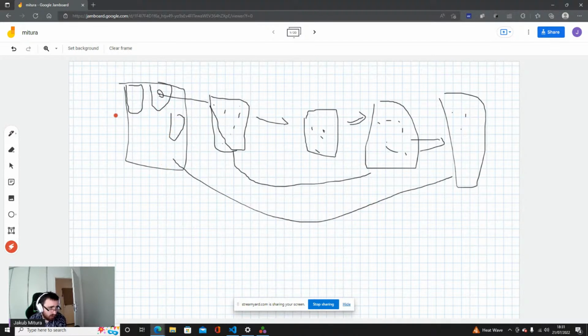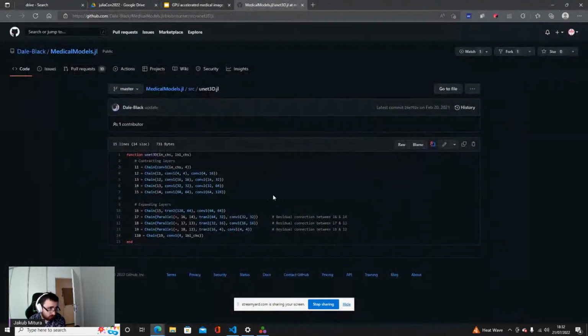Shape, because when we have these pooling layers, basically we get the compressed idea about the shapes of the things that we're interested in. But the information about the texture is mostly lost during these pooling operations. Still, in medical imaging, the information about the texture, so the neighborhood information, is extremely important. So in order to preserve this information, we have these skip connections. Okay, this is the basic idea behind it.